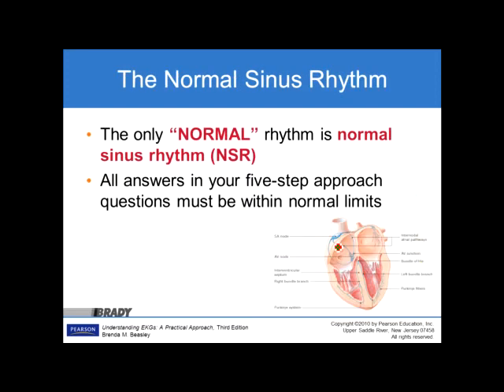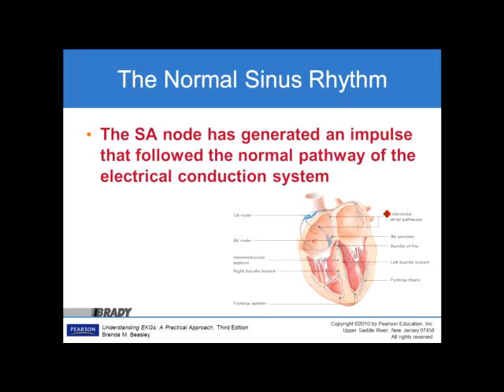Normal sinus rhythm. The only normal rhythm is normal sinus rhythm. All answers in your 5-step approach on this rhythm must be answered within normal limits. Again, just a quick brief before we go into this. Actually, we have another one on the next slide.